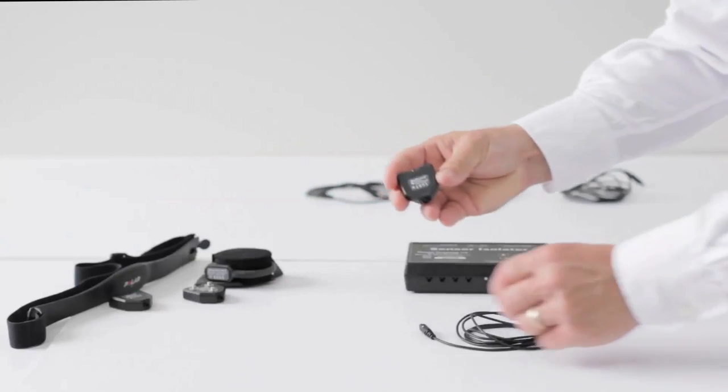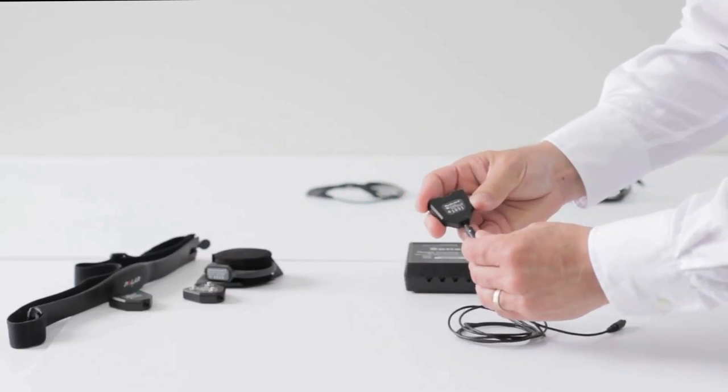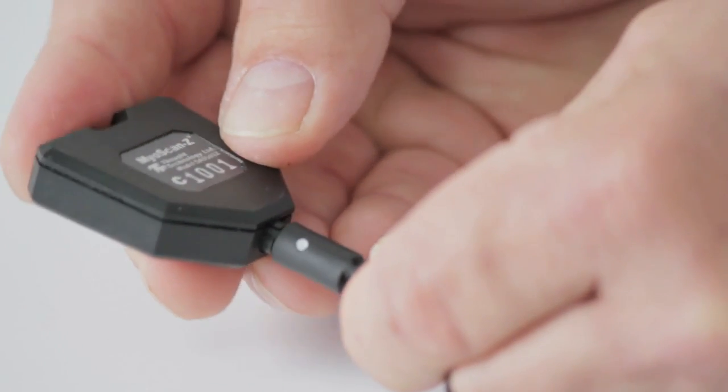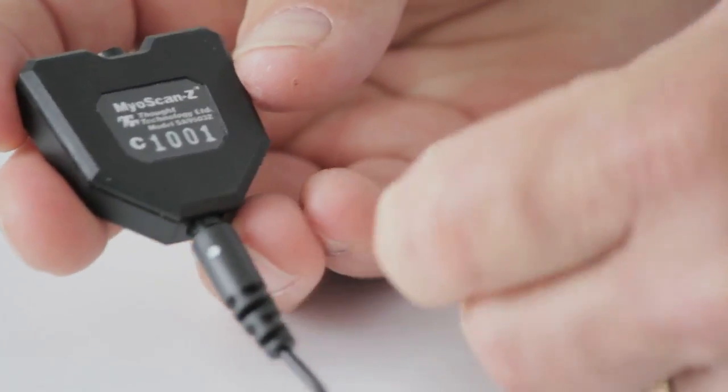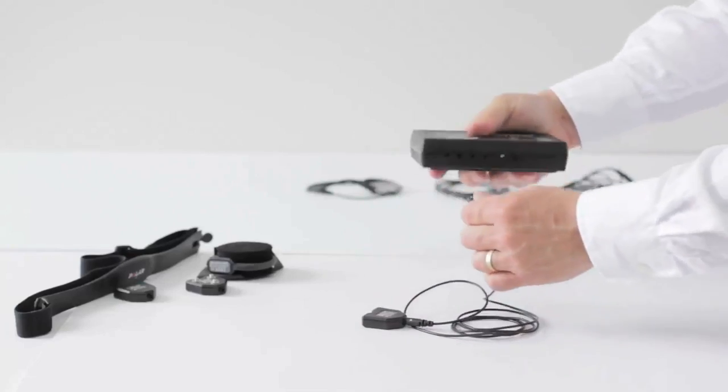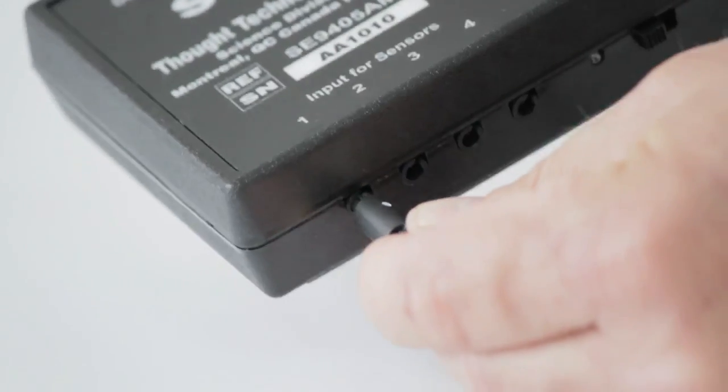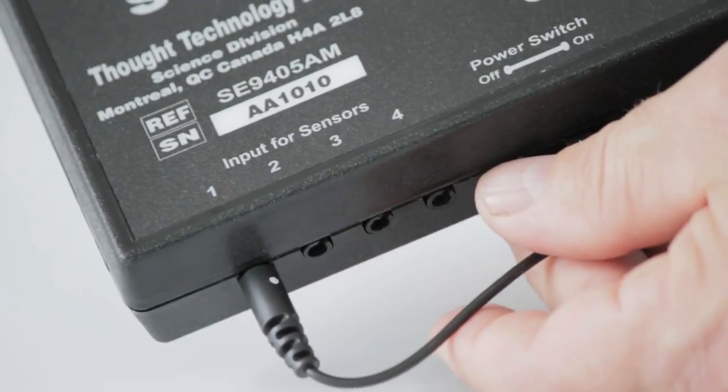First, you will need to set up the sensors by making the following physical connections. Connect each sensor to the sensor isolator using the provided sensor cable. In this case, the Myoscan amplifier used for surface EMG will be connected to channel 1.